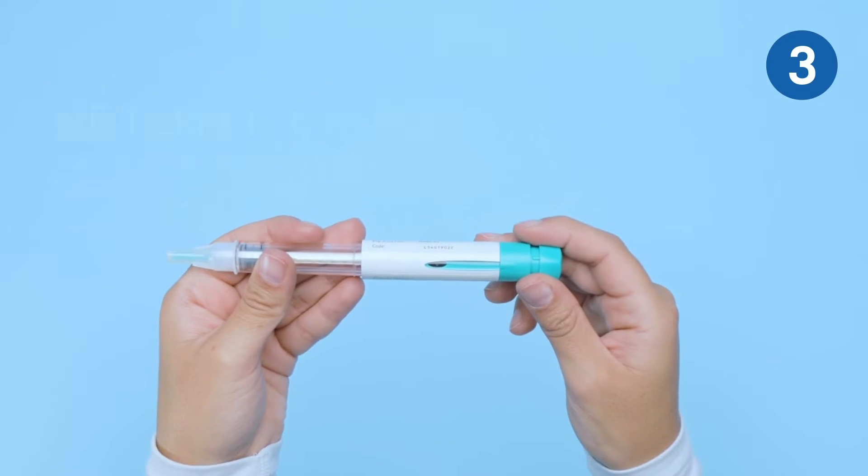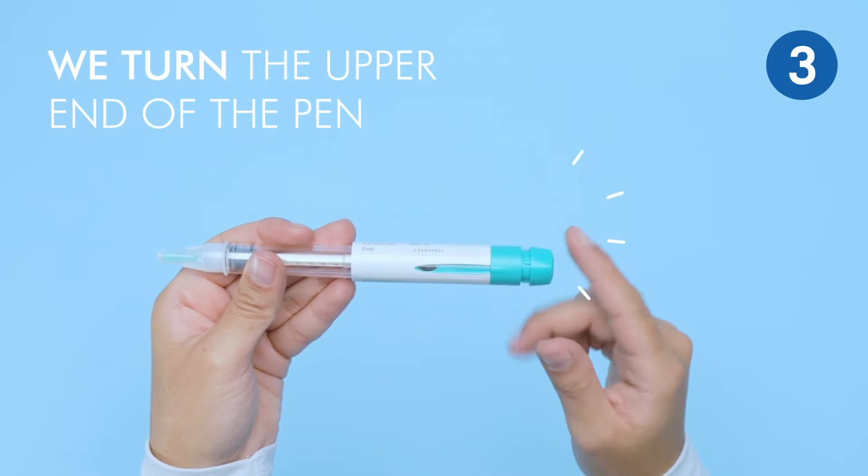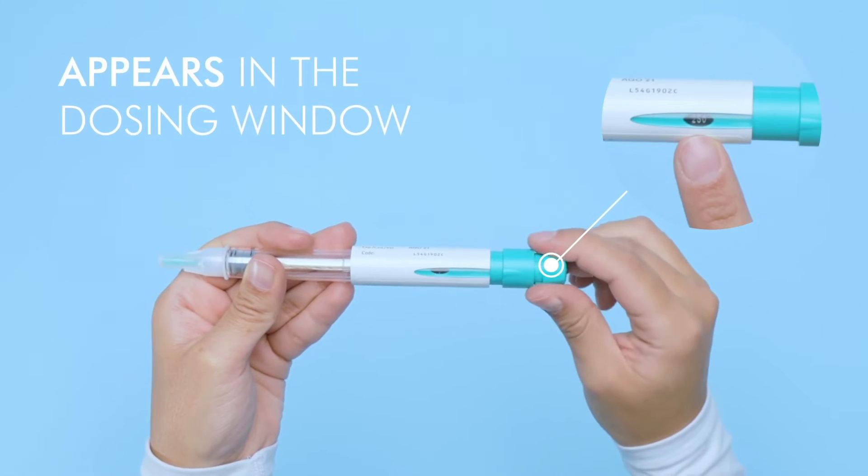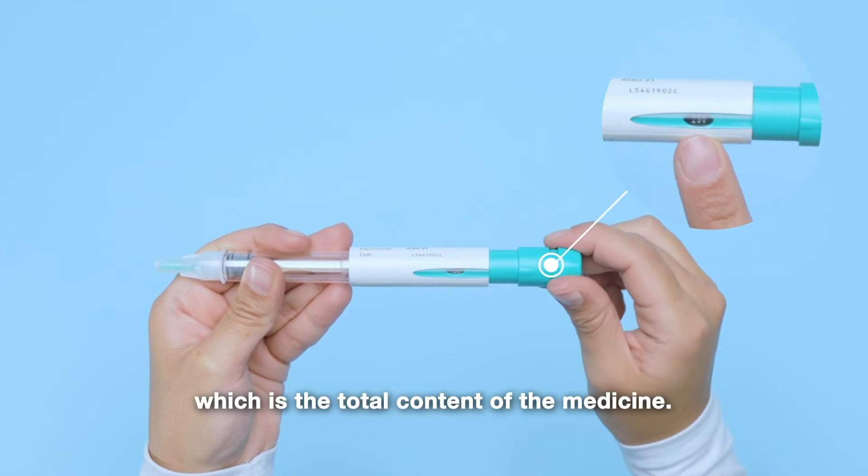To select the dose, turn the upper end of the pen until the number 250 appears in the dosing window, which is the total content of the medicine.